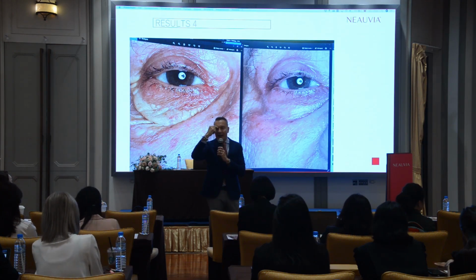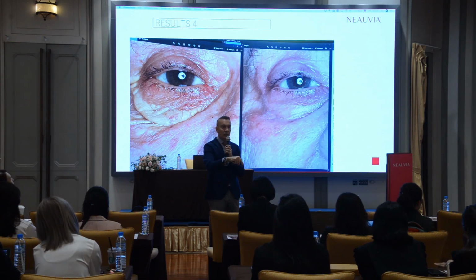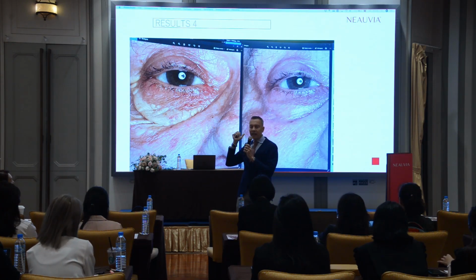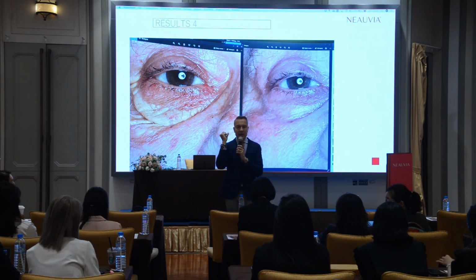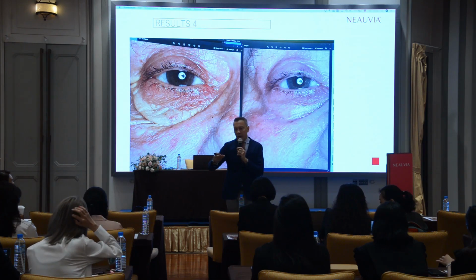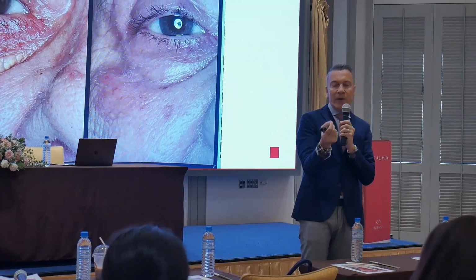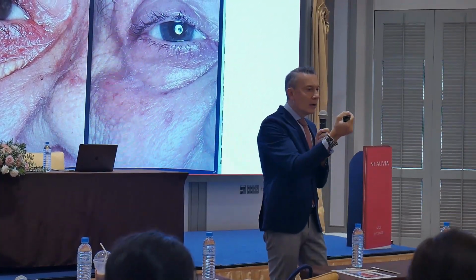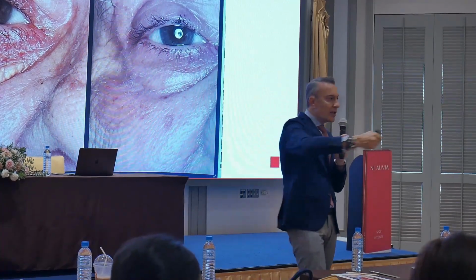I need to cut the skin. For the blepharoplasty, I have to use Sectum. But when I have cases like this, or skin tags, keratosis at this stage, I can use even the plasma. So with the plasma, we connect a return electrode, and we can also cut the skin. When we have a papilloma, when you have these tags, especially under the underarm, and you just want to cut, you can do it with the plasma.